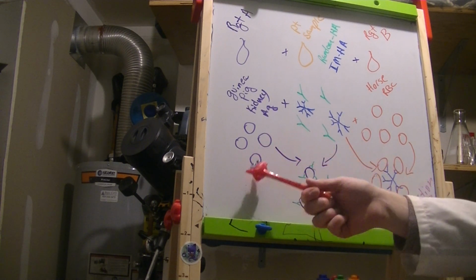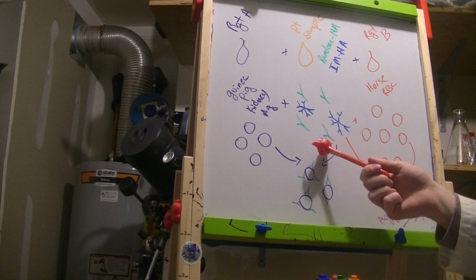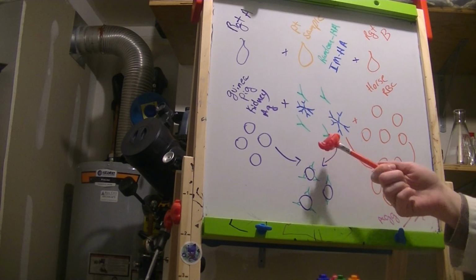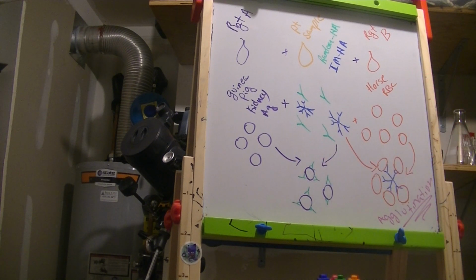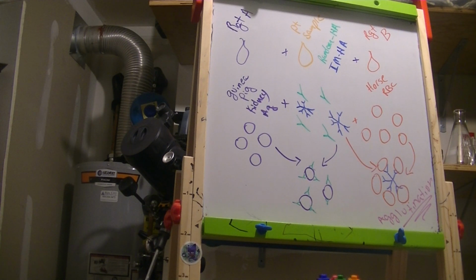Now, if we did not mix reagent A first, if we just mixed everything up together all at once, some of these random heterophile antibodies could actually take up binding sites on the horse red blood cells and prevent us from seeing good agglutination with our infectious mono heterophile antibodies. Or if those antibodies are good enough at agglutinating, they could actually cause agglutination to be seen when there actually are no antibodies present because of mono. So we could get a false negative result for our patient, or we could get a false positive if we don't mix reagent A first.